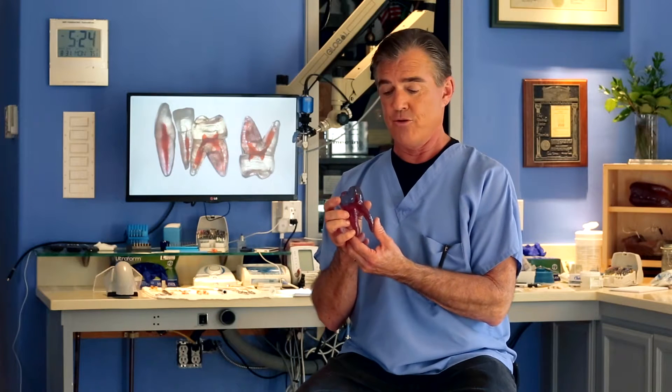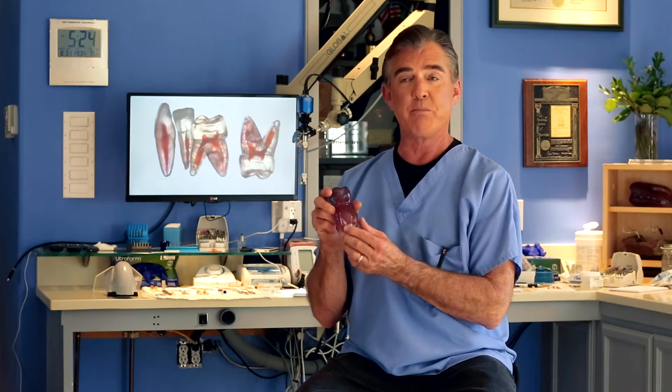This is a true tooth training replica that is printed five times its normal scale. It's a lower molar with mesial and distal roots and some pretty wild anatomy. 3D printing has changed everything in our world, and more than most things it changed how we teach dentists to do root canals, because for the first time we control the anatomy.